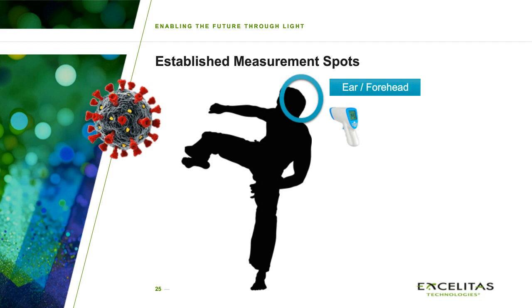Yes. So this is why in this example, we have shown that you might use, for example, a camera with a face detection software, which you can have easily in any software package. Another possibility would be to have a proximity sensor, an active proximity sensor with a low field of view, which will simply tell you that a person is in the right spot.